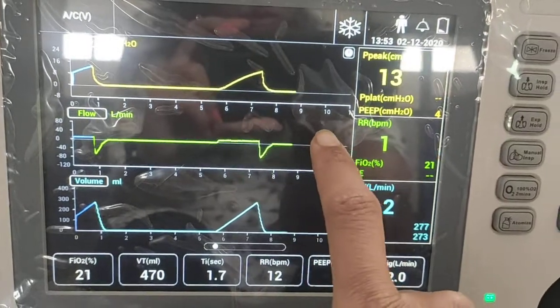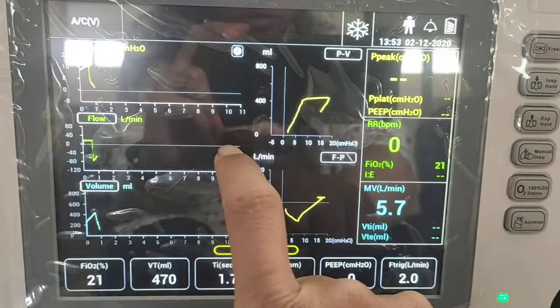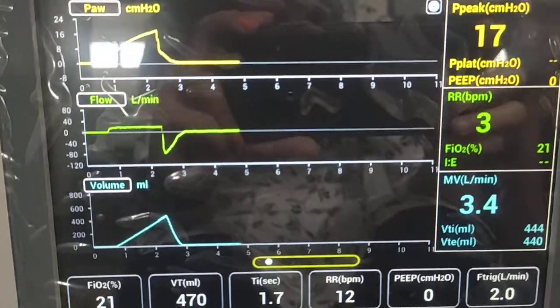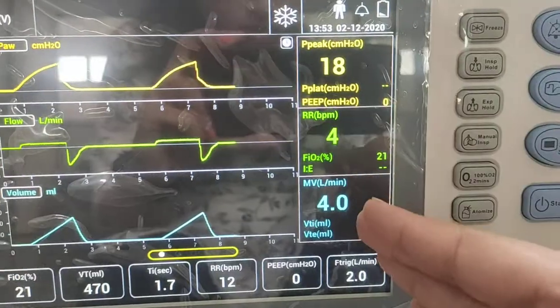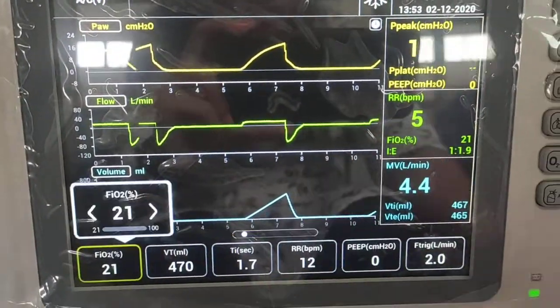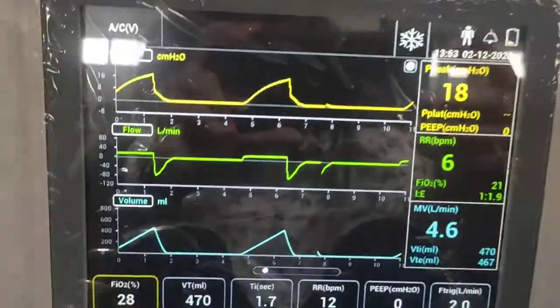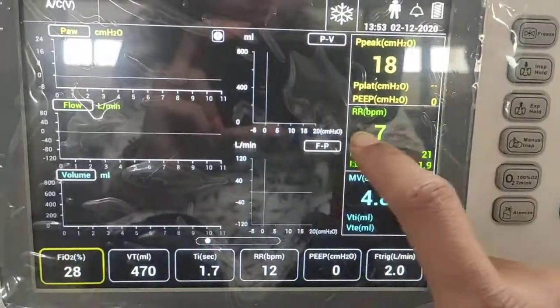This is the ventilation screen. There are different types of screens — to move between them, just slide across. The first screen shows three waveforms: pressure, flow, and volume. Monitored parameters are displayed, and users can change parameters using the rotary knob. Press the button to confirm a selection.